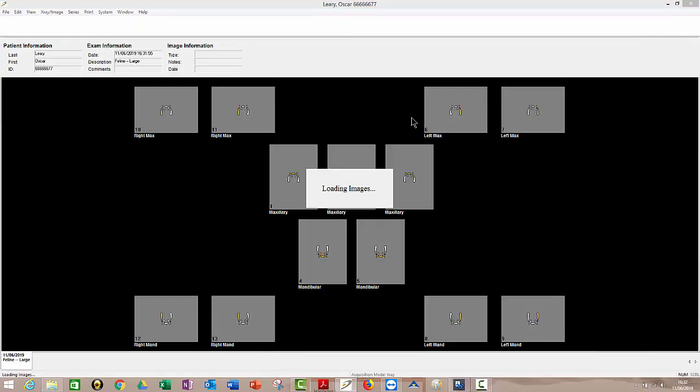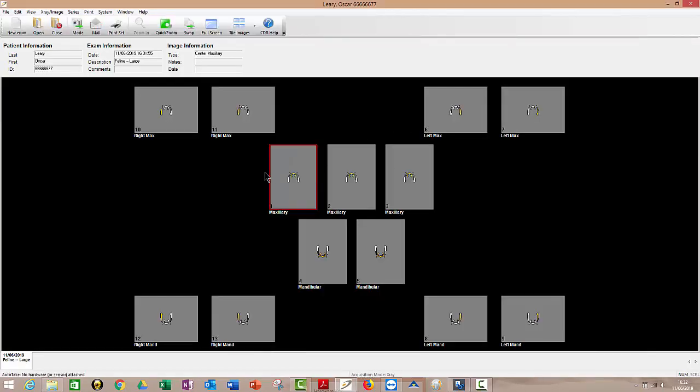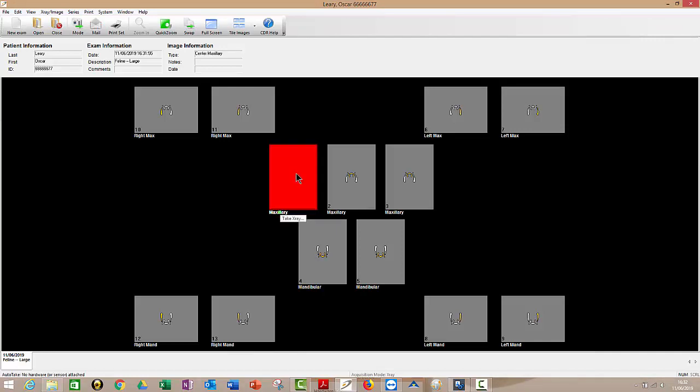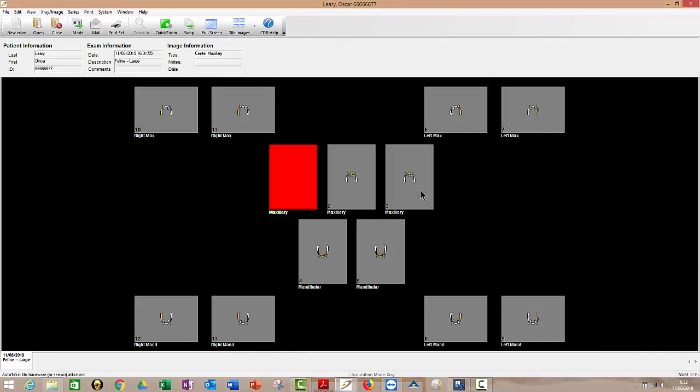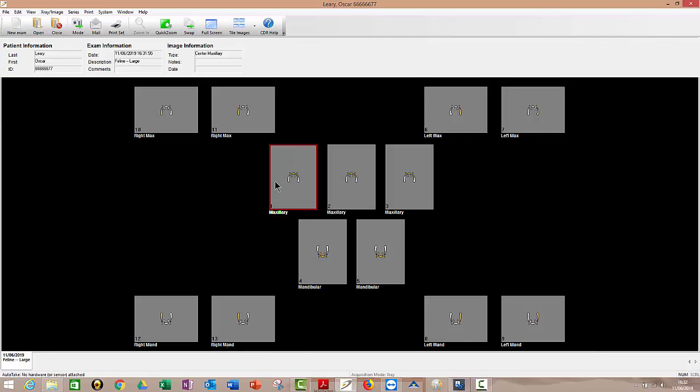I have a flashing red box here because I don't have a sensor attached. But if you had a sensor attached now, you'd see a flashing green box there. Now, if you notice, these boxes are numbered sequentially one, two, three, all the way up to how many is it? I think it's 13 by the look of it. So it's expecting me to put the sensor in the animal's mouth, fire my X-ray source at it, and my image will appear in this box here.